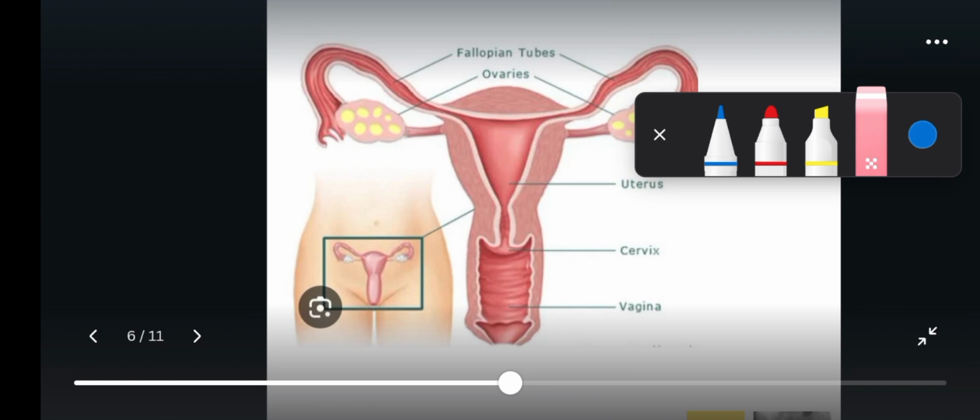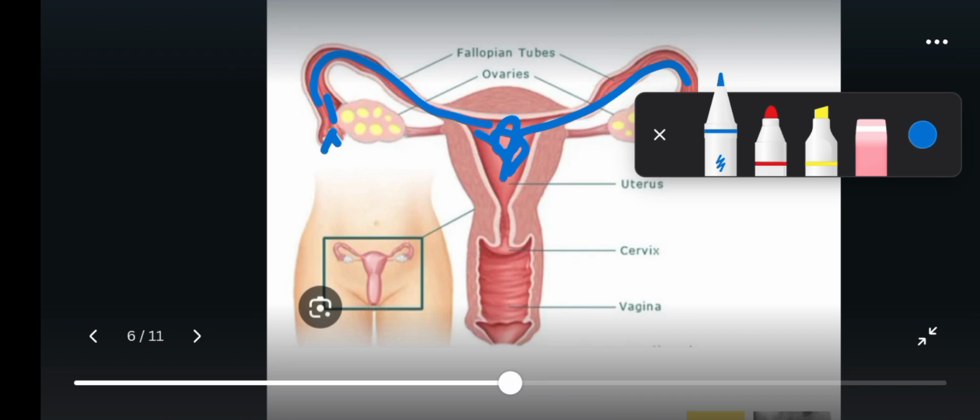We can now inject the dye into the cannula to outline the inside of the womb and to trace this opening, and we expect, if here is open, for the contrast to flow out freely.